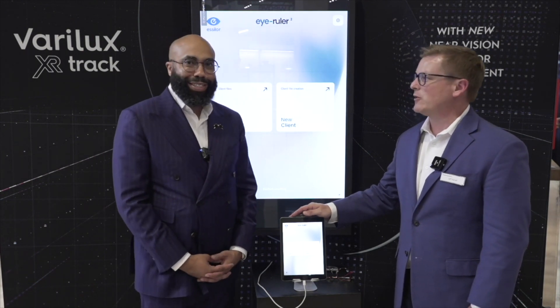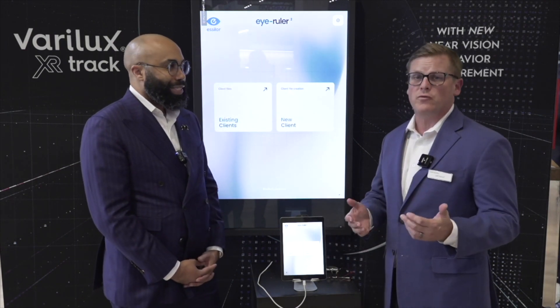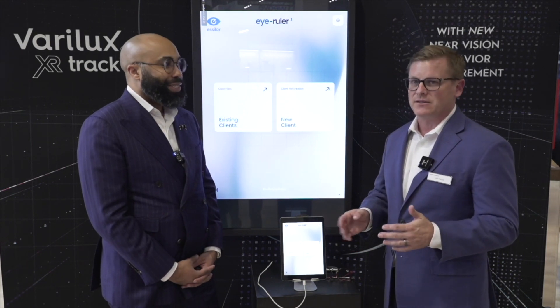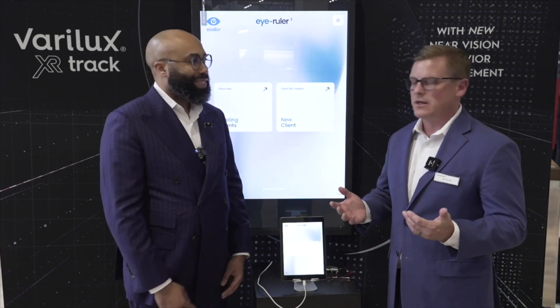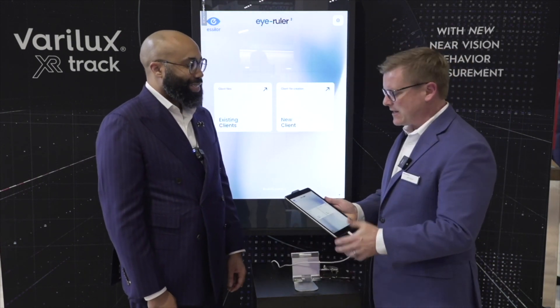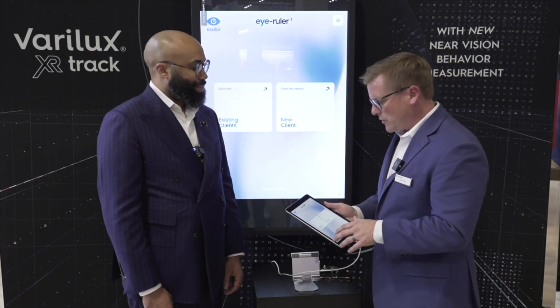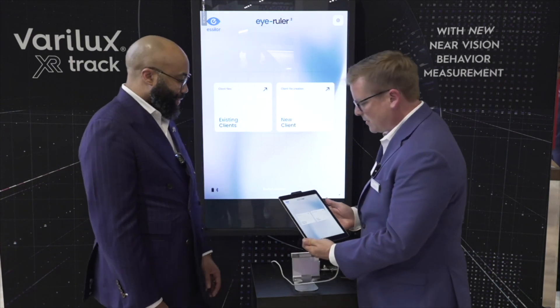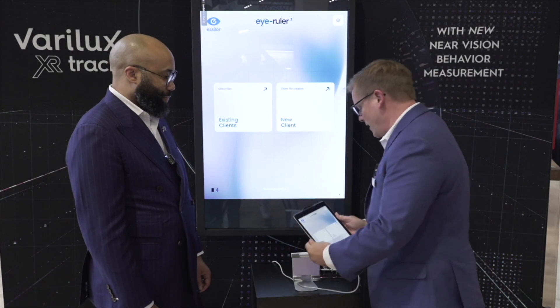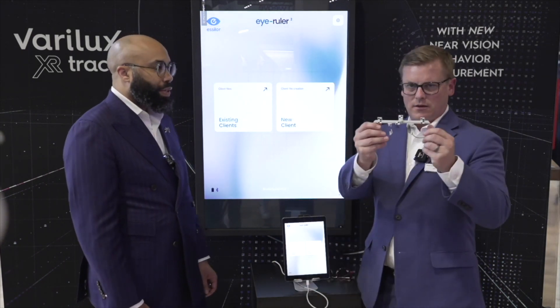It's sold through the Essilor Instruments division. We're also talking about this as it relates to the new Verilux XR Track, but this device can be used for any patient in the practice. It really helps elevate that experience in the dispensary and gives patients confidence that real time and care is being taken with their measurements. The iRuler 2 comes complete with a camera, the iPad, the software, and the clips — the clips are where the sensors are located.